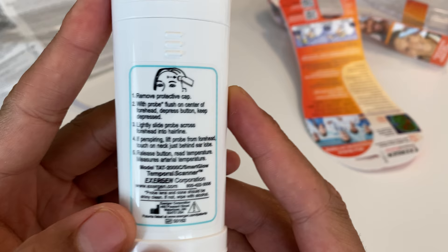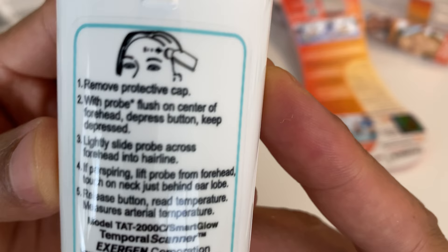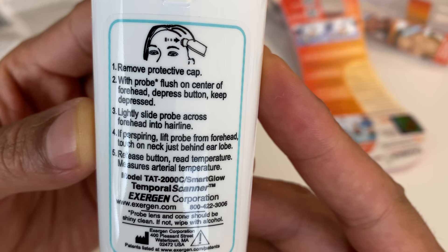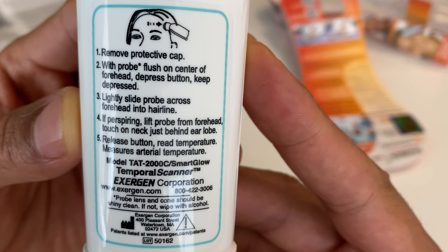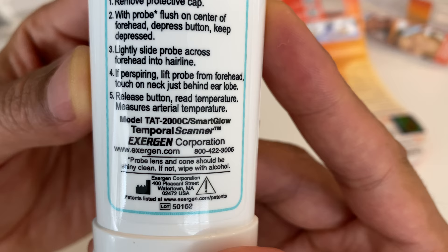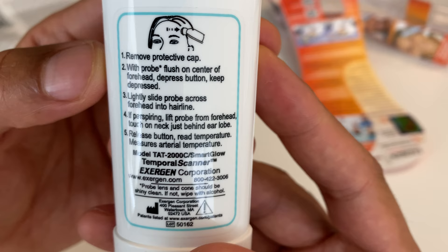The back says: remove the protective cap, with probe flush on center of forehead, depress the button and keep depressed, then lightly slide the probe across the forehead to the hairline. If perspiring, lift the probe from the forehead and touch on the neck or just behind the earlobe as an alternative. Then release the button and read the temperature — it measures arterial temperature.